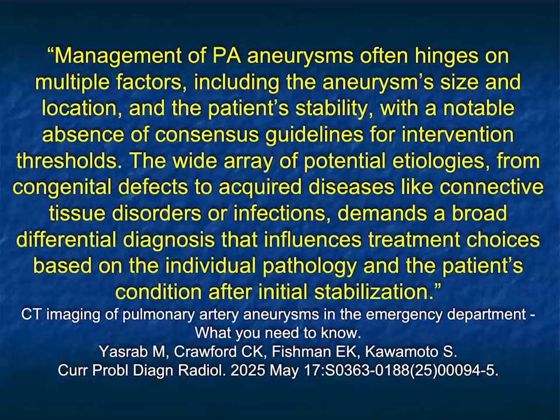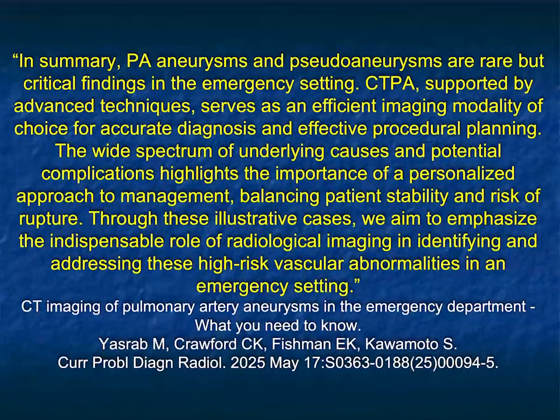Now, we spoke about the management, including aneurysm size and location, the patient's stability, and whether or not it's bleeding. Again, treatment from embolization with coiling to resection will depend on the patient, the size of the process, and the clinical presentation. So I've gone through a number of things with you.